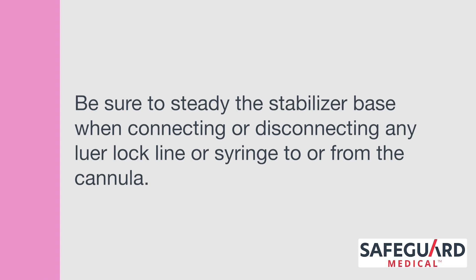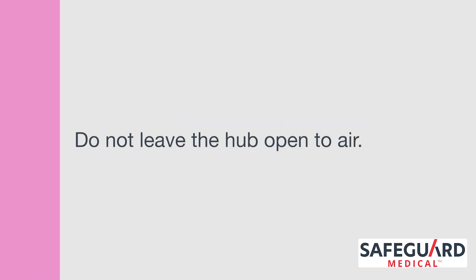Be sure to steady the stabilizer base when connecting or disconnecting any luer lock line or syringe to or from the cannula. Do not leave the hub open to air.